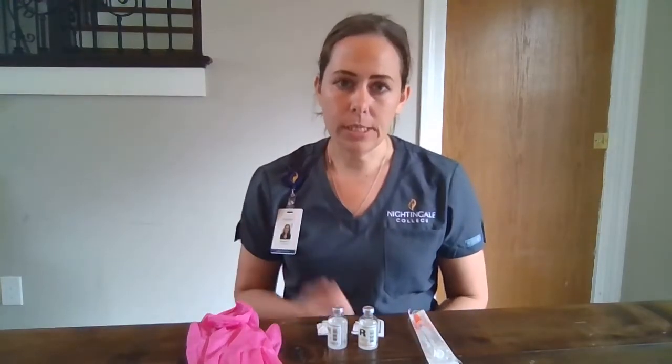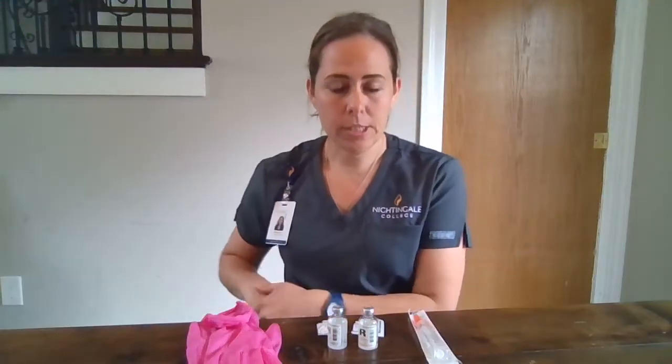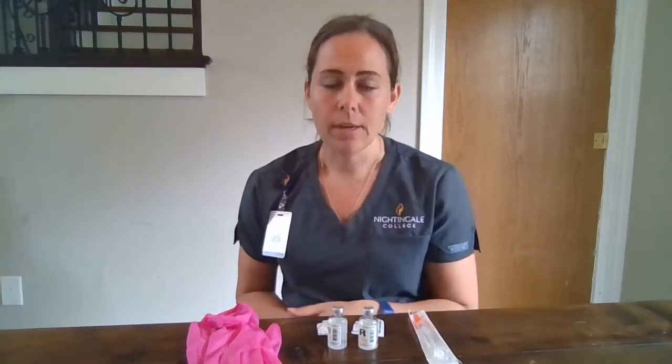I'm going to gather my supplies, enter my patient's room, close the door curtain for privacy, and perform hand hygiene. Hi sir, I'm Kim. I'm going to be your nurse today. Can you verify your full name and date of birth? Verify with two patient identifiers.